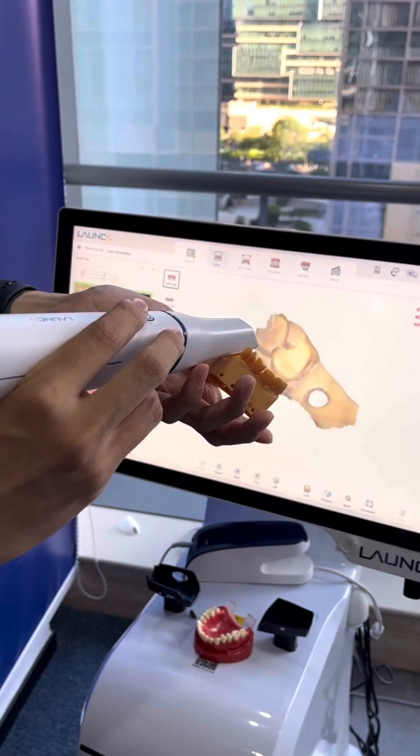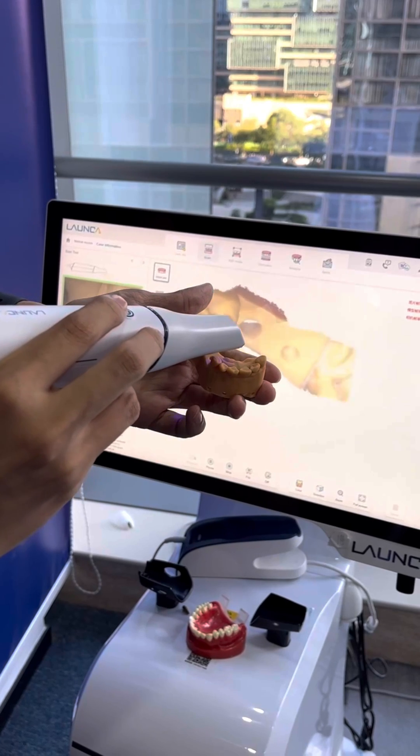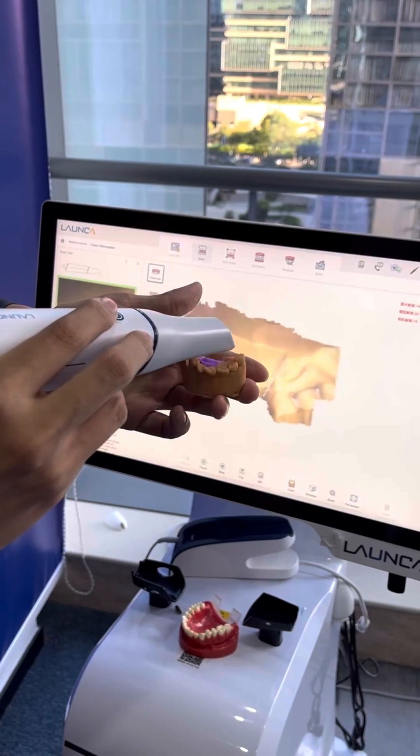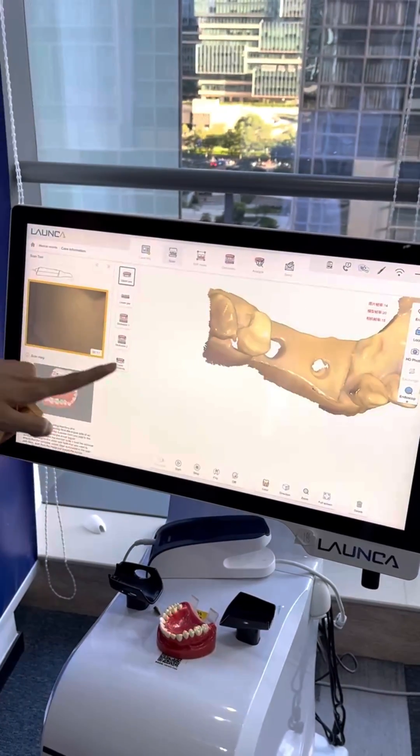For this time, you will scan without the scan body — this is only the gingiva. That's the upper jaw without the scan body.